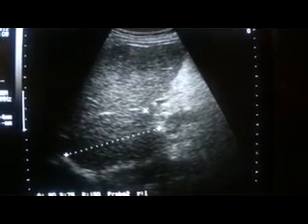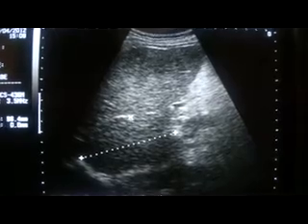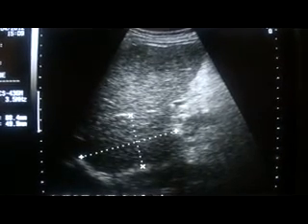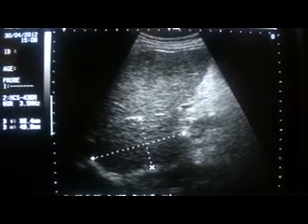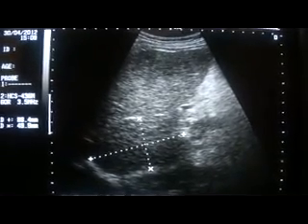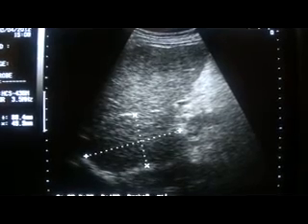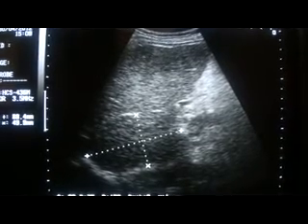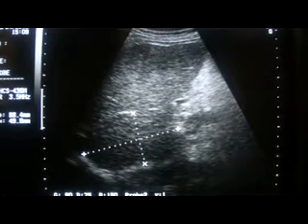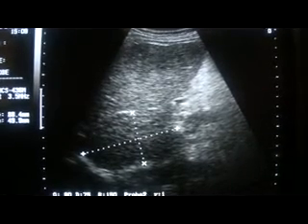For the rest, this is the left lobe of the liver in transverse section. This segment was to show you how at times you will see caudate lobe hyperplasia in patients with advanced stage cirrhotic liver. Though it is not a rule to see this, but if you see it, you should know what it means.